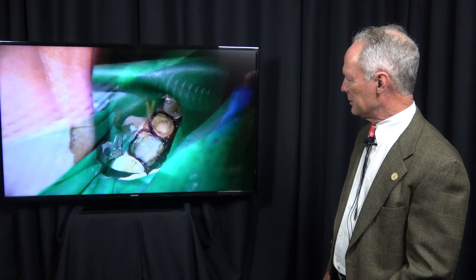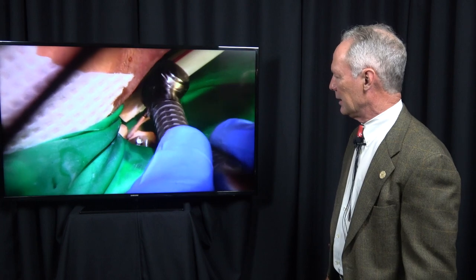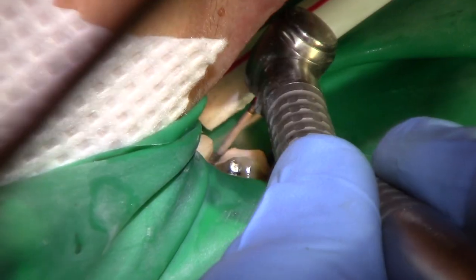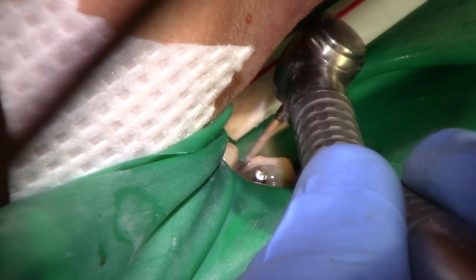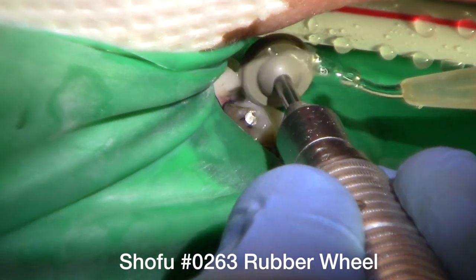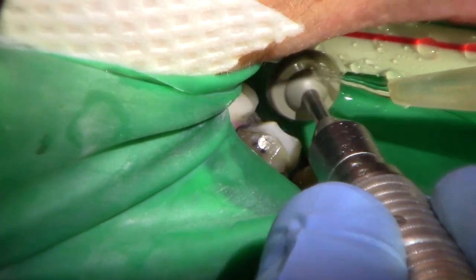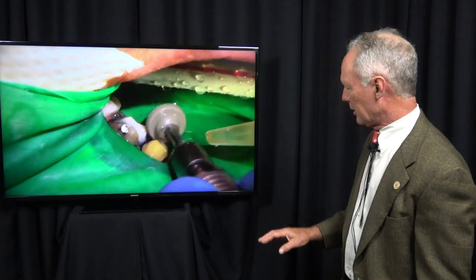The composite build-ups are in place, and I'm going to come back and prep those, blend them into the crown preparation with my chamfer and flame-shaped diamonds. Then, I'm going to polish it with the Shofu rubber wheel. You don't have to do that, but I just want to be sure I don't have any sharp line angles.